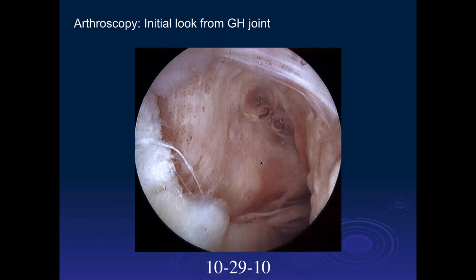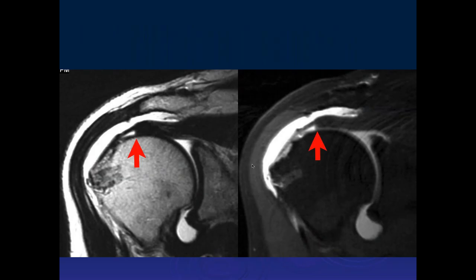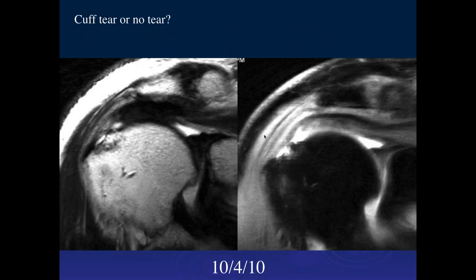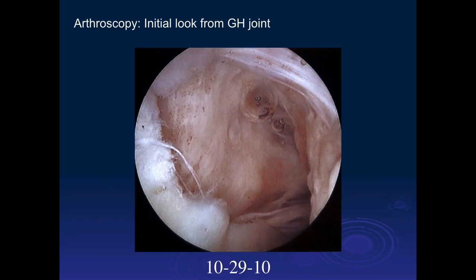So it's important in looking at cases like this to really look at where the musculotendinous junction is and where the distal tendon is. You can then infer that this is really a complete tear with scar in situ, which changes management — because this was a complete tear and the patient did well with surgery.